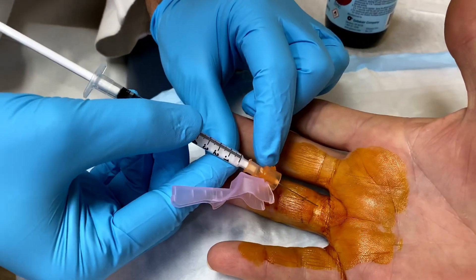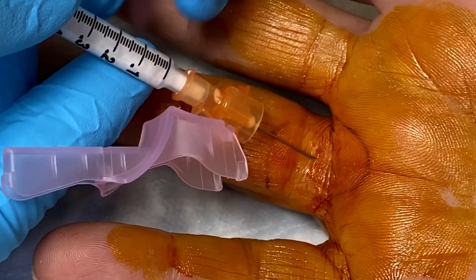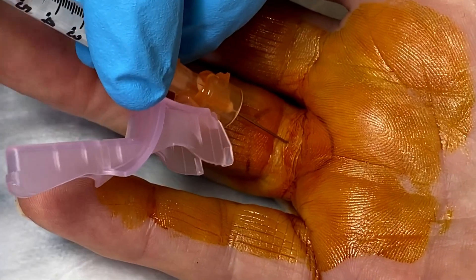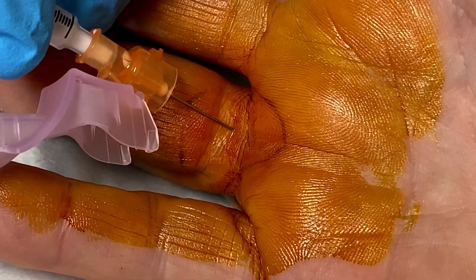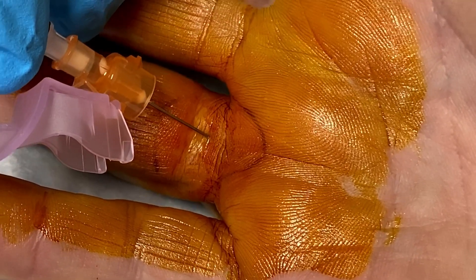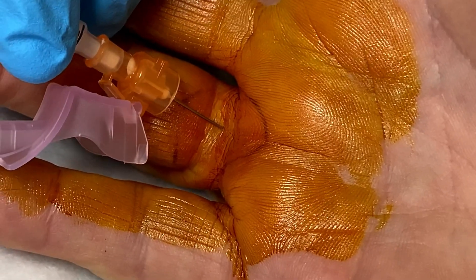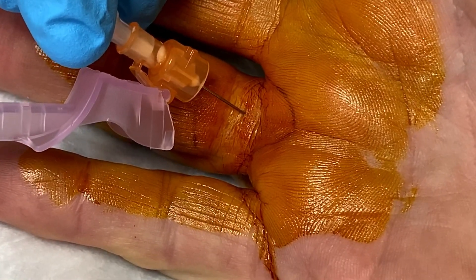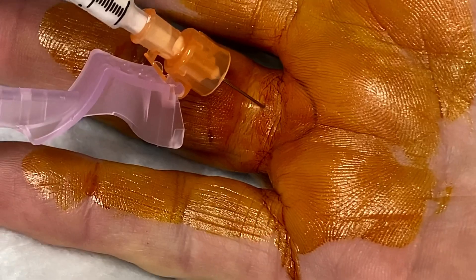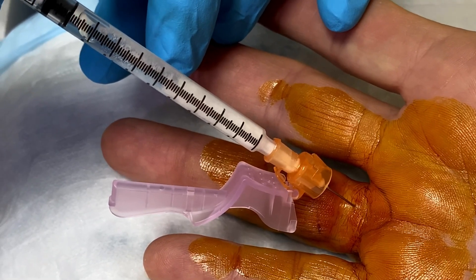Remember what I told you about moving your finger a little bit for me? Okay, move it — not quite that much. Straighten it, then bend it, and straighten it, and bend it, and straighten it. So now that we're in the tendon sheath, we inject, and you can see that the medicine goes in very easily.